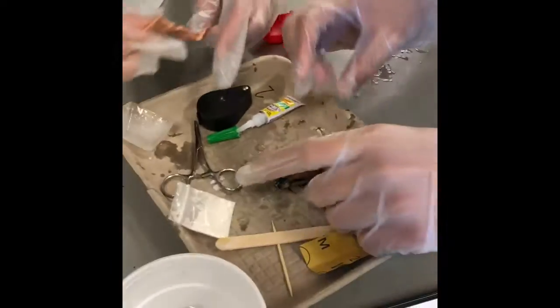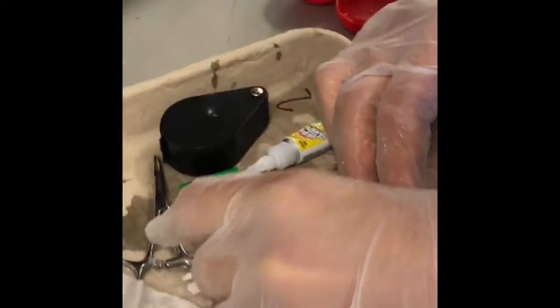Place the cockroach in the ice water again and take it out to move one wing to the side. Use silly putty to help hold down the wing and stabilize it. Dry the thorax with a cotton swab and sand it down.